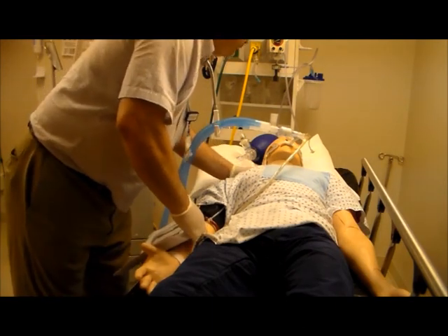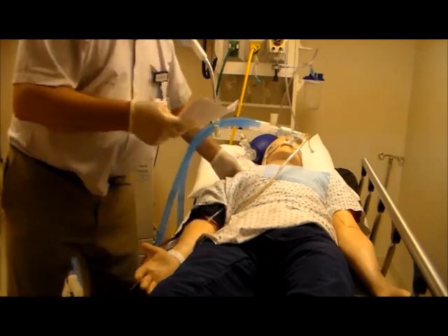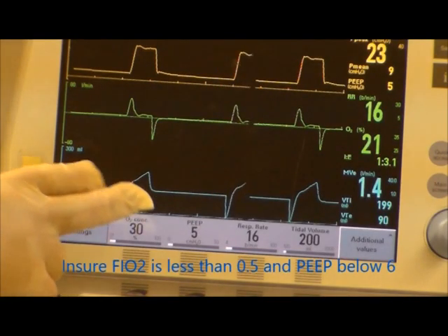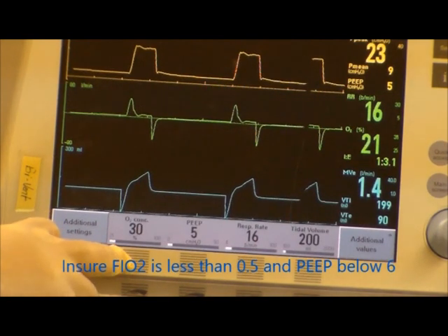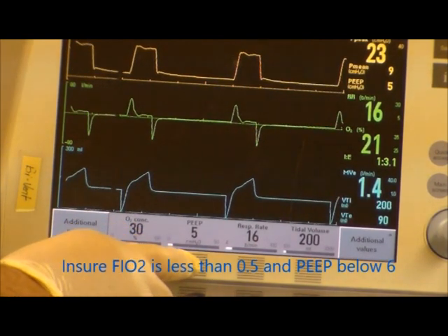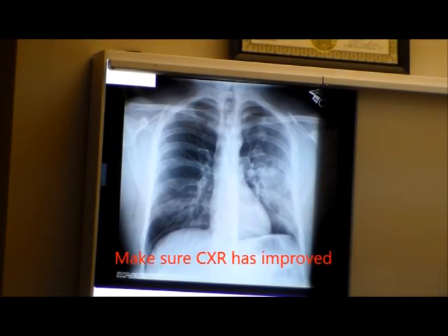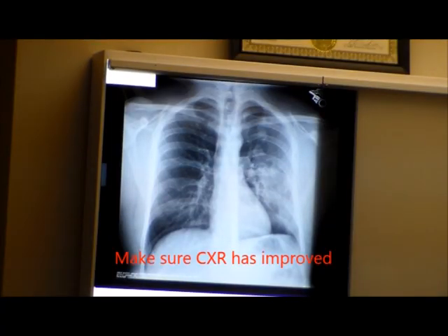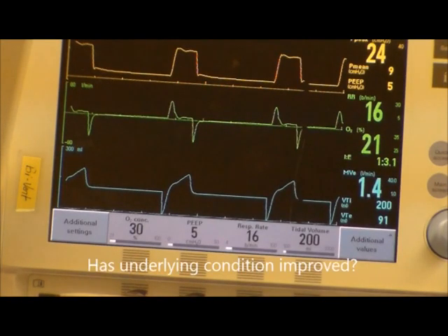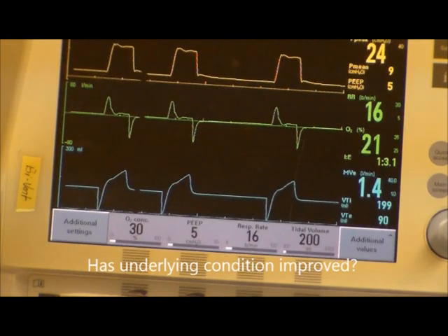Any pain? You're feeling fine? Good. You want to check and make sure your FiO2 is less than 50%. Check the PEEP — is it less than or equal to six centimeters of water pressure? Make sure your chest x-ray has improved, and most importantly, has the underlying condition that caused your patient to go on the ventilator in the first place begun to resolve?